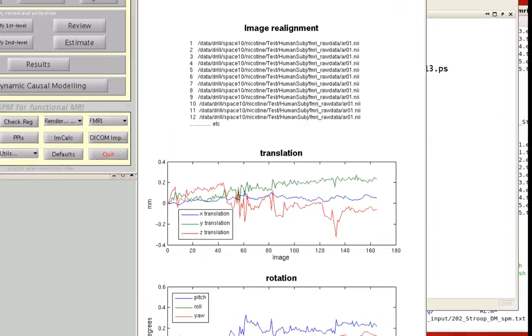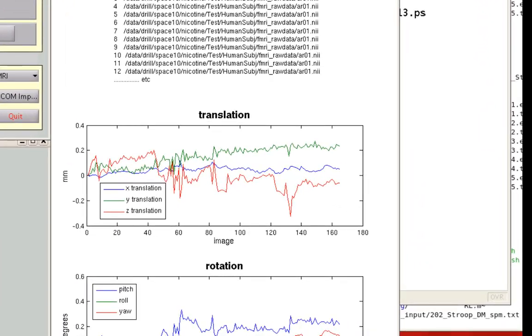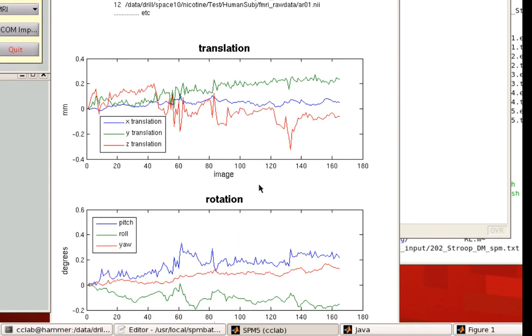After Estimation and Reslicing is done, you'll see an output of the image realignment. There are translation parameters which estimate how much each image deviated from the first image in the X, Y, and Z coordinates. You can also see displacement in the pitch, roll, and yaw directions.